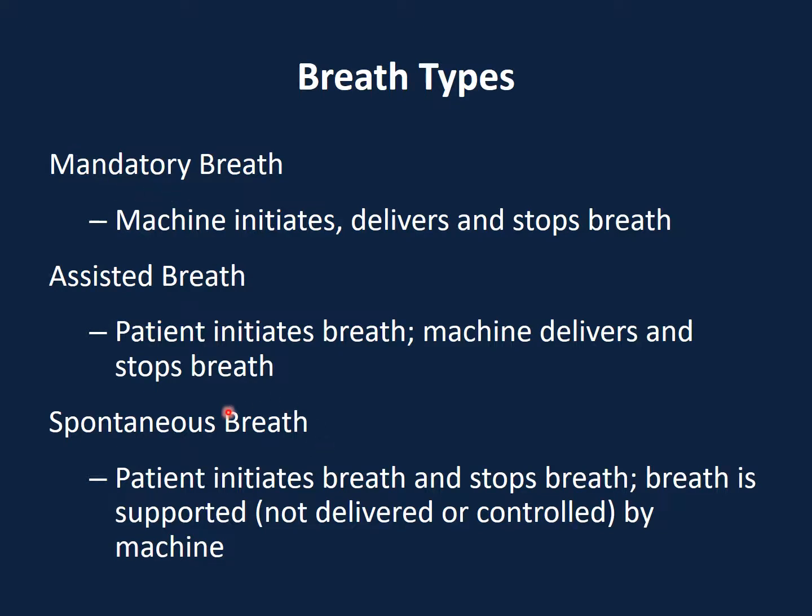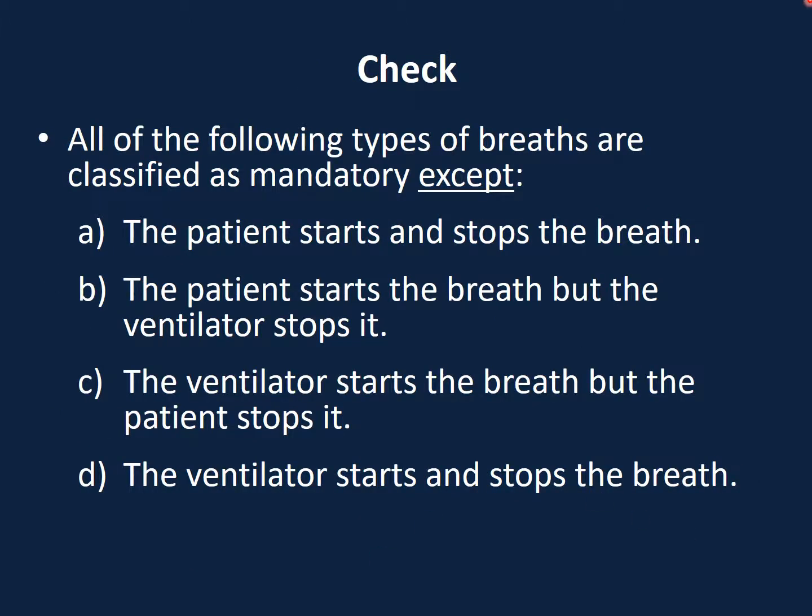Then on the other side, we're talking about spontaneous breath, where the patient really can spontaneously breathe. It's just that the breath is supported by the machine, not delivered, not controlled. So the patient can initiate the breath and can initiate the stopping of the breath. Therefore the inspiratory time is set by the person him or herself. The volume or the depth of breathing is also controlled by the patient, and not by the machine. So a very quick check for this question, and the answer for this is A, right?